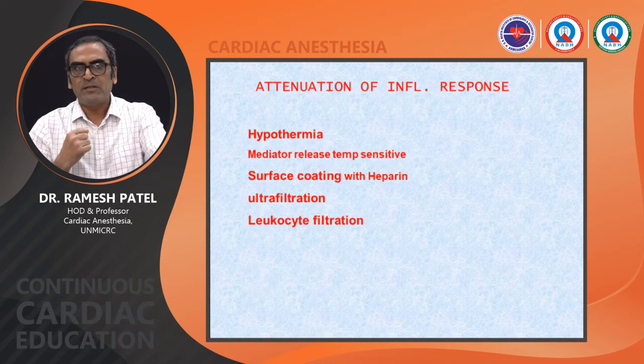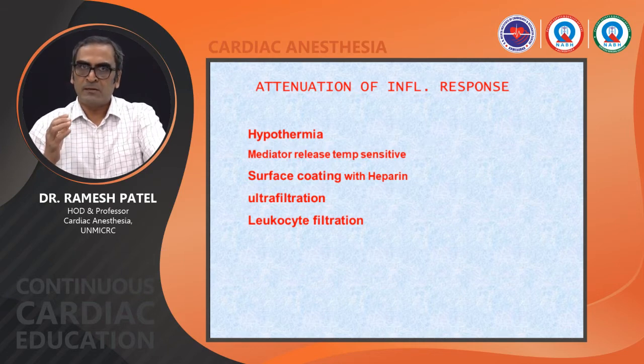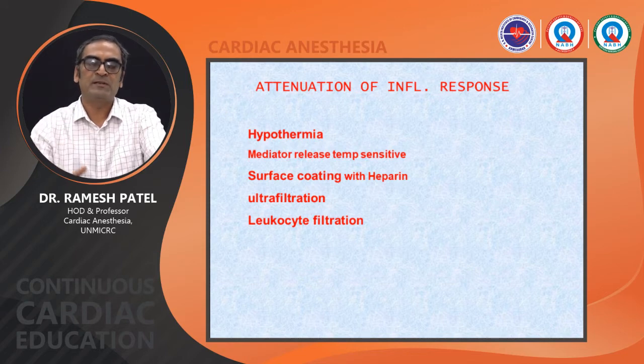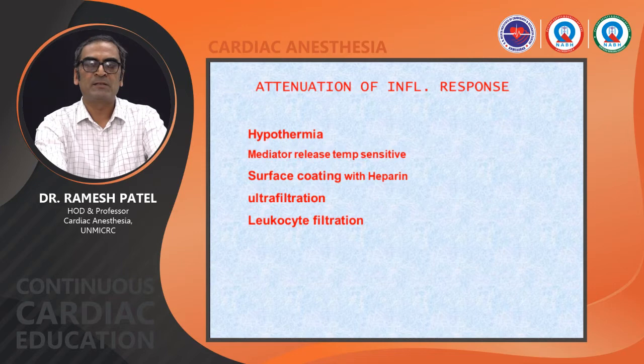And how do we attenuate the inflammatory response? There are some strategies, like hypothermia. The mediator release is temperature sensitive, so hypothermia will attenuate the systemic inflammatory response. Surface coating with heparin is also helpful. And of course, ultrafiltration and leukocyte filtration are modalities to prevent the systemic inflammatory response.